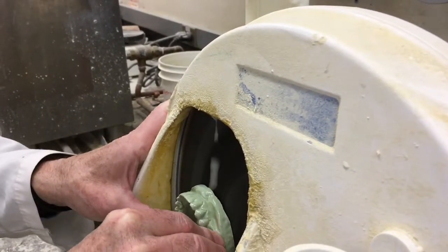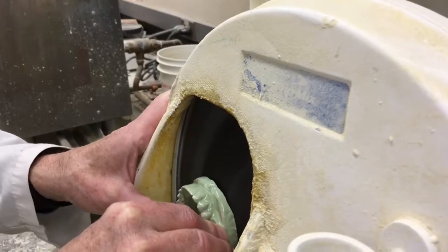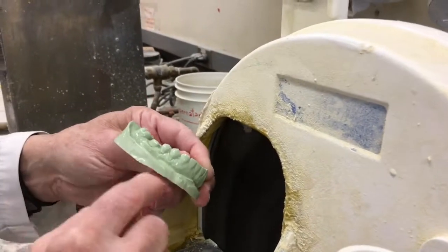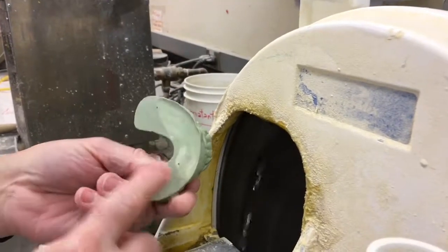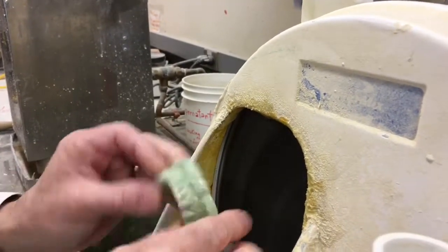Push evenly on both sides. I want the base of the cast to be parallel to the occlusal surface, and we grind it so that the base is perfectly flat.